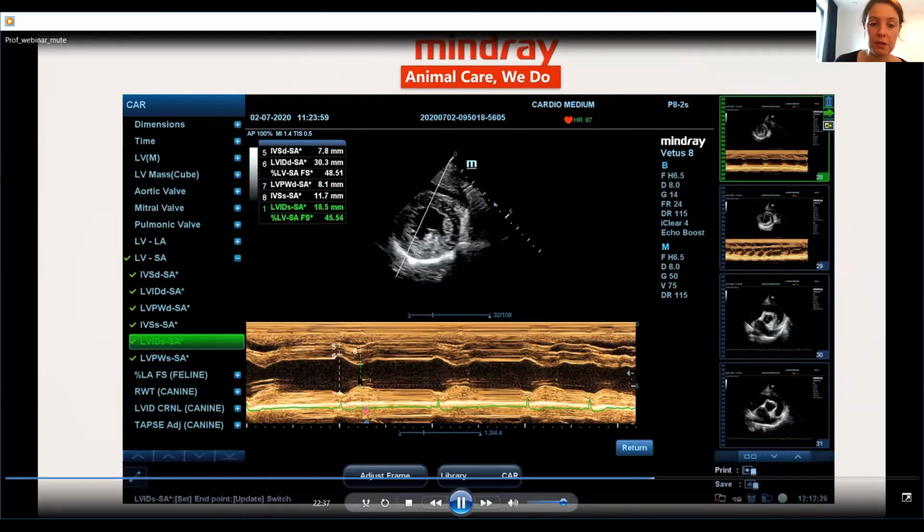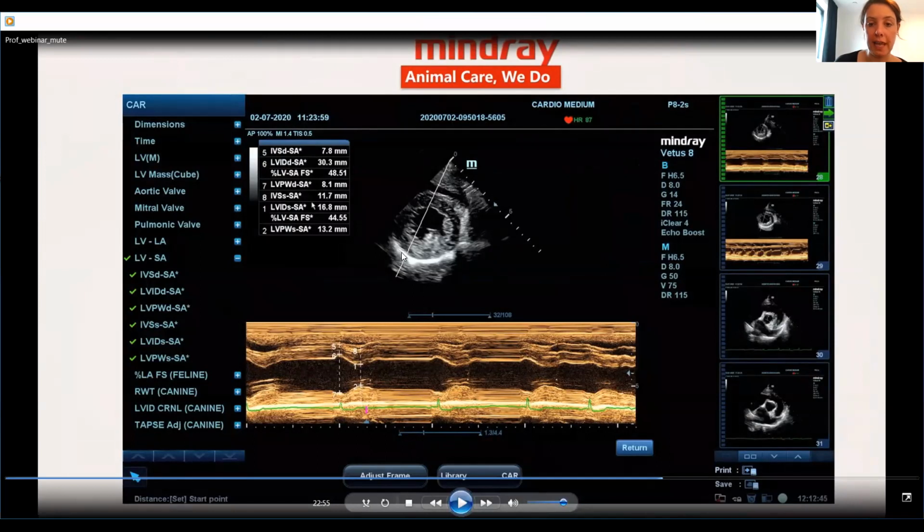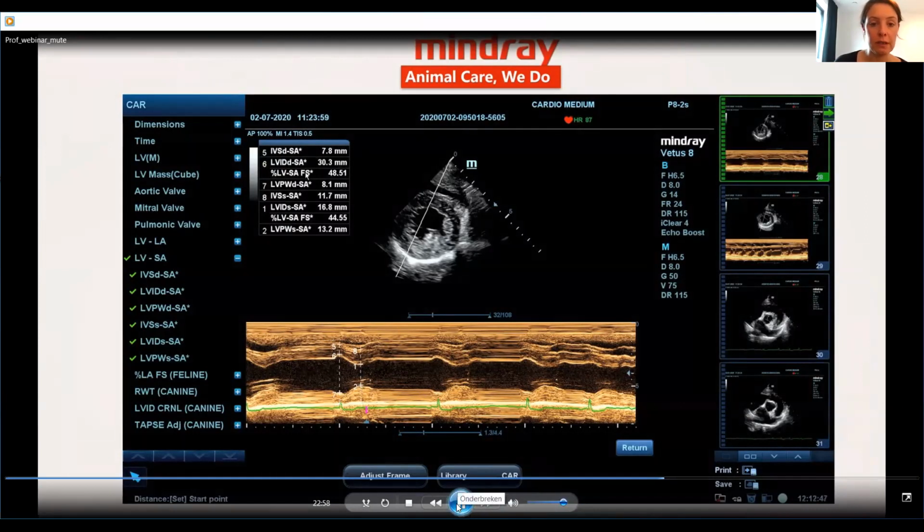Next is, after the T wave, we are here in systole. This is the thickness of the septum in systole, the lumen of the left ventricle in systole, and then the thickness of the free wall in systole. Because this is what you actually see when you put your line. The first thing you see is right ventricular free wall, then you see the lumen of the right ventricle, then you see the interventricular septum, the lumen of the left, and the free wall. So this is how you dissect your heart, and this is then how you see these structures set out over time. Okay.